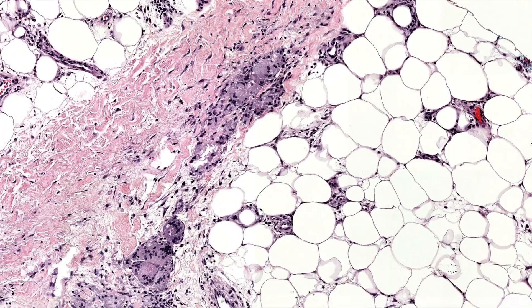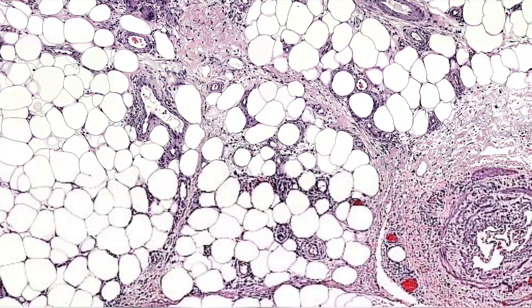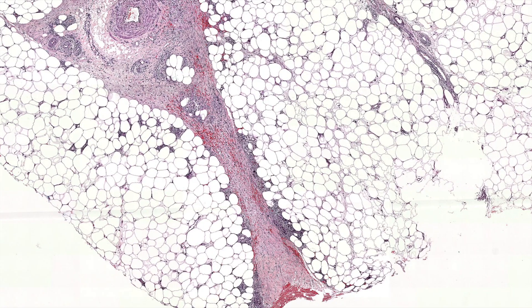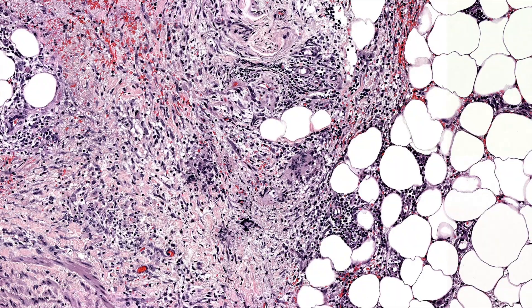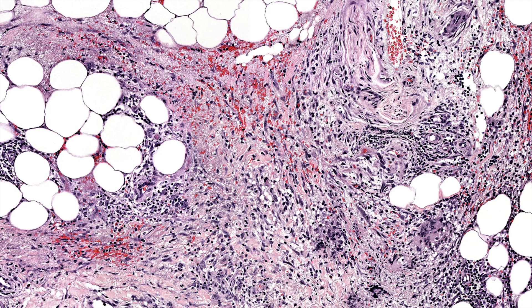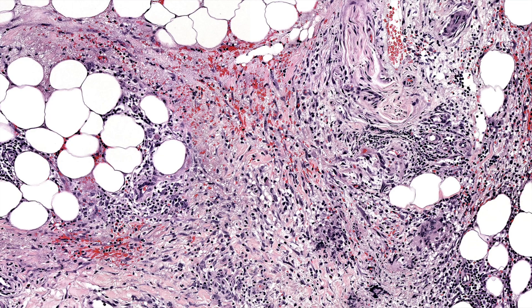You get vague little clusters of giant cells and granulomas, often with foam cells — a mixture of inflammatory cells including neutrophils sometimes. As the disease progresses, you get more of that fasciitis-like granulation tissue that begins to mature and turn into more collagenized, sclerotic scar. Eventually the inflammation burns out and you get scarred bands left over. Here's another one of those vague granulomas — really good for erythema nodosum. You may also see fibrin, neutrophils, nuclear dust, and some vasculitis or vascular damage.